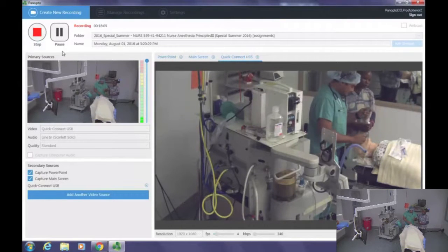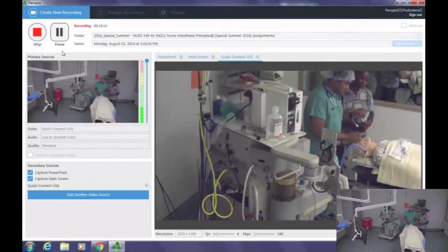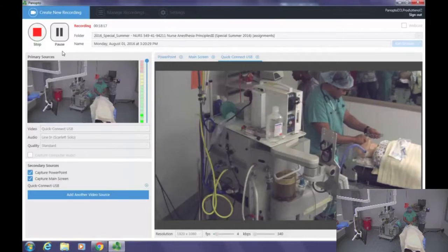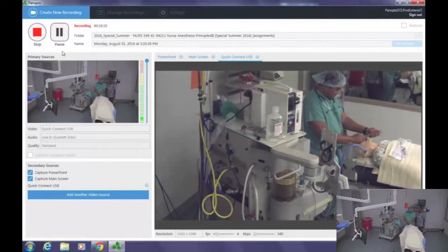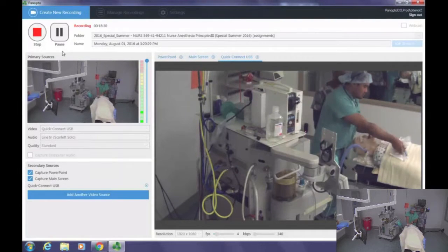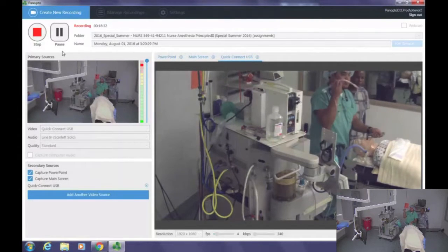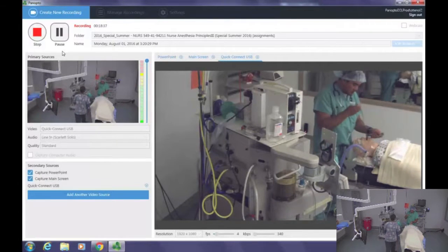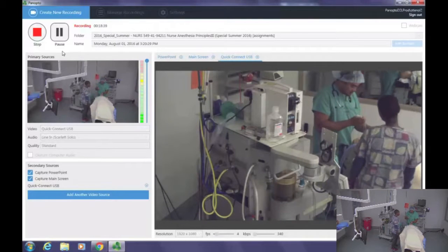We're going to intubate the patient with a double-lumen tube. First, we're going to use a Mac blade. Gently. Make sure you see the vallecula, and you see the epiglottis, so you could go ahead. With the double-lumen tube, you have to make sure that it's tip up. I'm just going to simulate this.